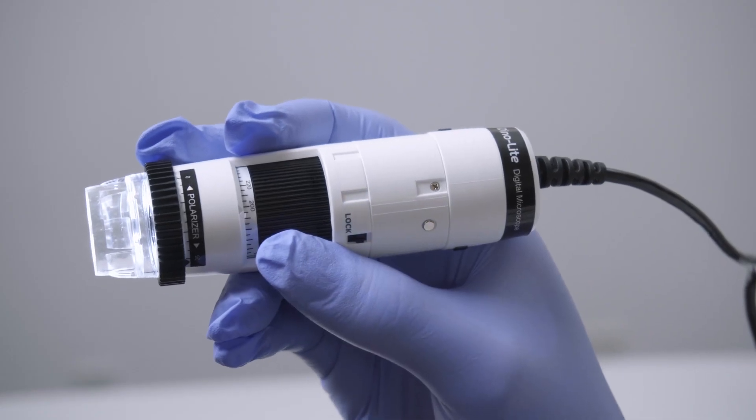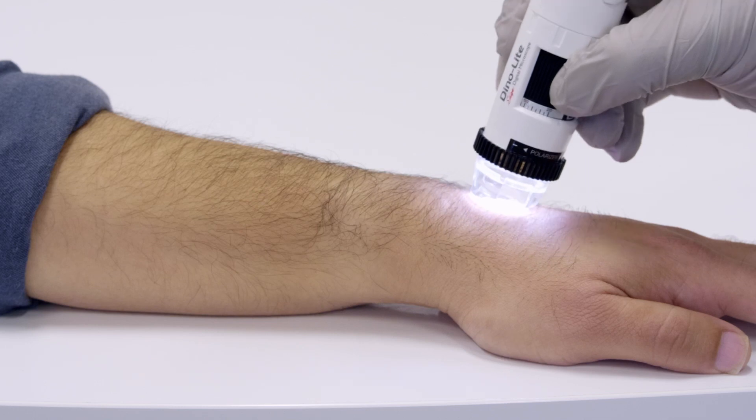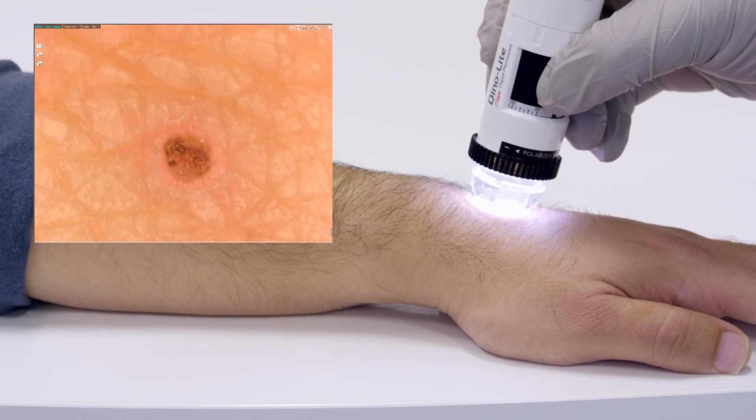Face the Dynolite logo upwards for proper image orientation. Gently place the device onto the skin and adjust the focus by rotating the dial.